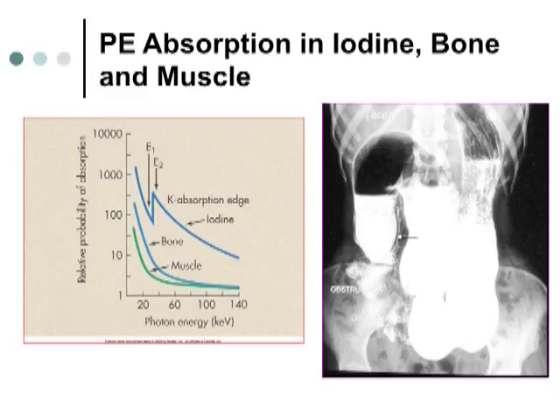But we want photoelectric effect. Does it ionize the patient? Does it cause harm? Yes. But there's always some risk associated with the benefit that we get from diagnostic X-ray. Better off having photoelectric effect than Compton scatter. Compton scatter doesn't contribute anything to the image on your film. It just adds a layer of density. We call it fog.